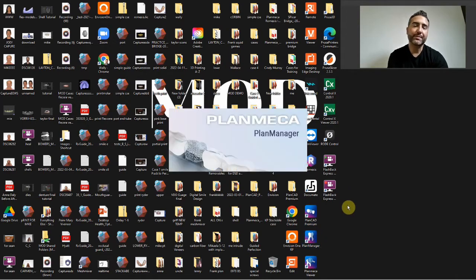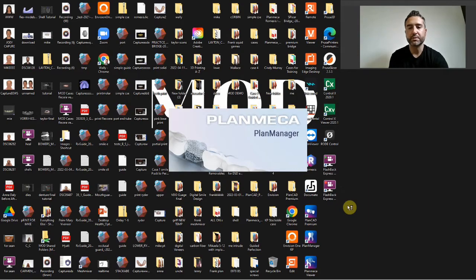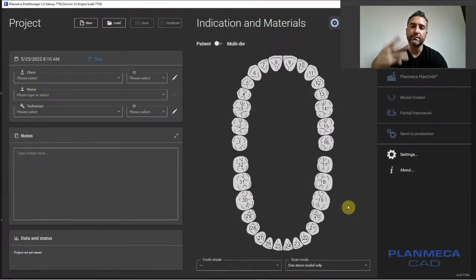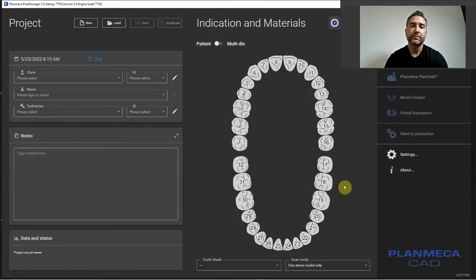I'm going to open up PlanMeka's version of ExoCAD called PlanCAD Premium. It's full-blown ExoCAD Galloway Ultimate, so if you're running ExoCAD, you'll be able to perfectly follow along.